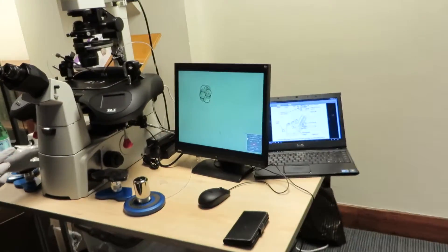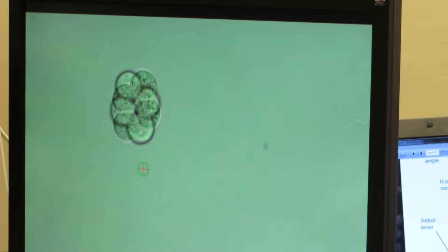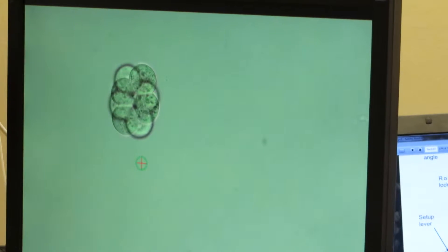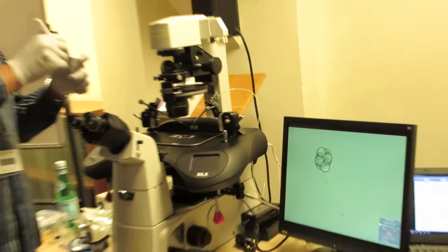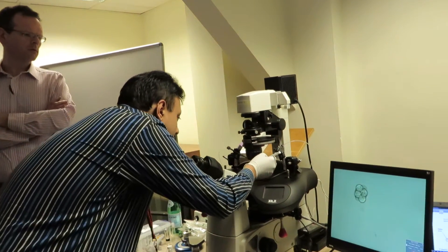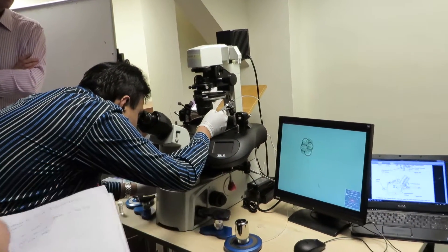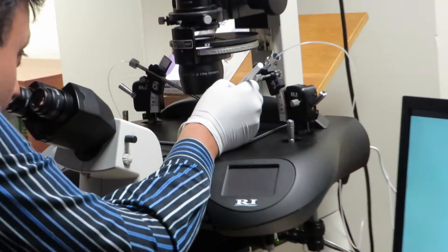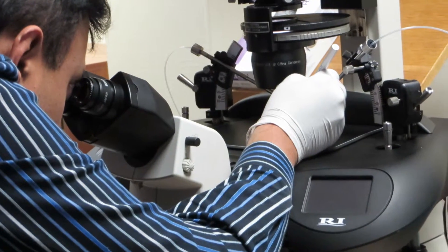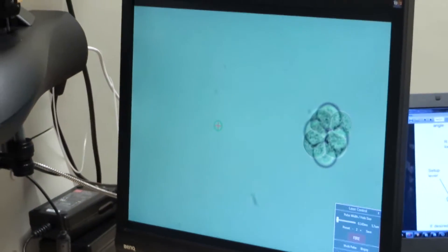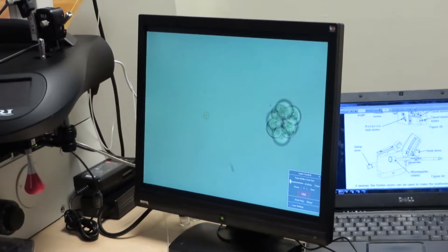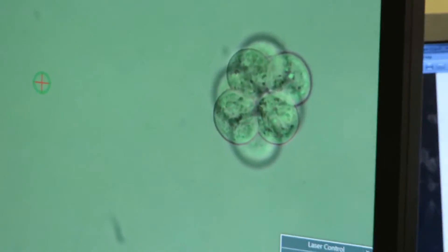So there's the embryo. The zona has already dissolved. You can see that the zona is gone. So bit by bit, you will see all the cells that will start breaking the cytoplasm. So you'll just get a solution. This can take a bit of time, and especially here we've got a whole embryo, so the cells don't all lyse at once. They lyse at different rates.